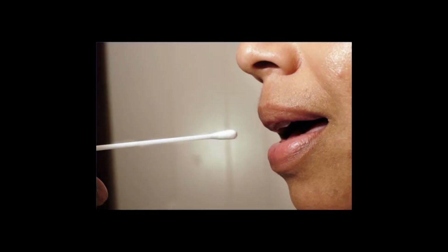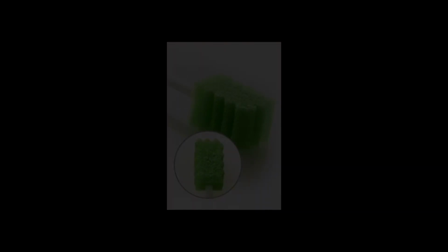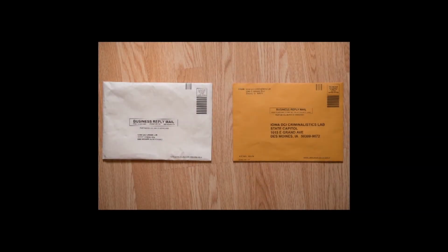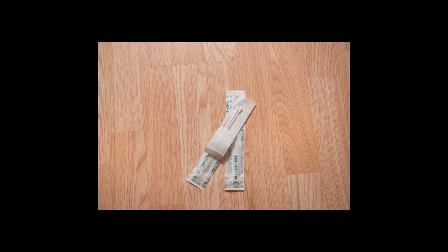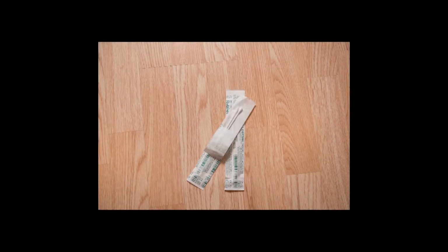The following video shows the steps of a collection using the new DNA database kits released in 2013, as shown on the left. If you have remaining collection kits containing cotton tip swabs, like those shown on the right, please use them prior to starting on the new kit model. Also, please note that this does not change how DNA samples should be collected for Casework samples. Please continue to use cotton-tipped swabs for the collection of known samples for submission to the Casework section.